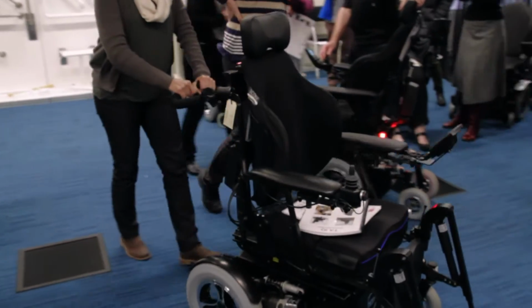Does the client actually want to do this? I've got bogged down before with all sorts of alternative controls, and the client will then say, actually, I'm quite happy to be pushed. I've done my driving now, it's getting too hard for me. I don't want to look like this with all this head array around me. Just push me.